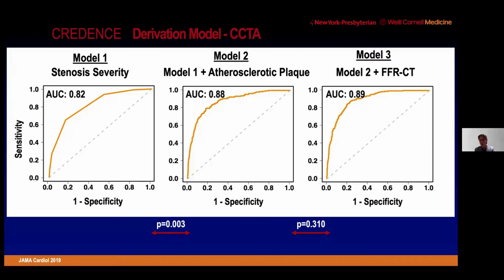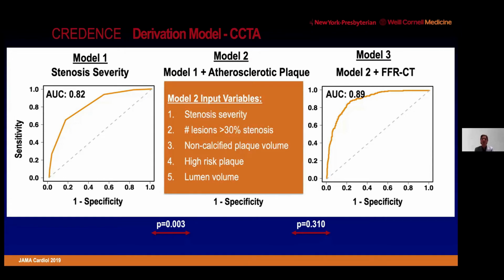So it's important. But I think the most important thing of this trial was that if you take a close look at your CT on its own, beside just the plaque severity, look at the additional plaque features, that you can come pretty close to the computational fluid dynamics features that we have with FFRCT and competitors alike.